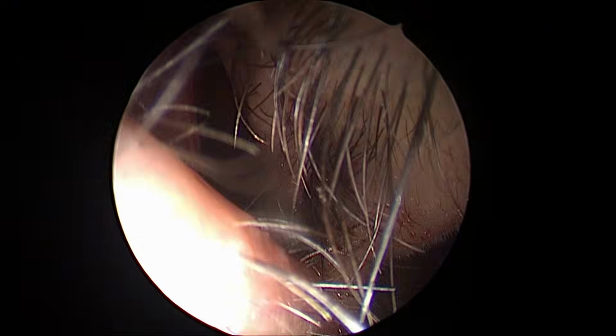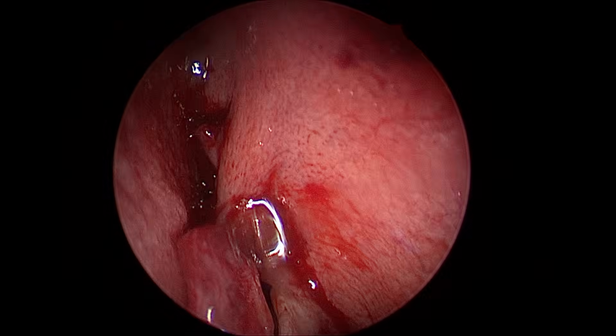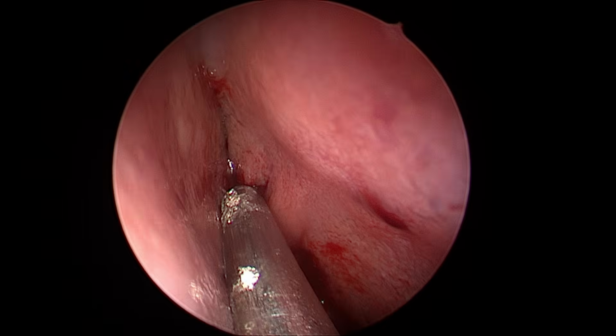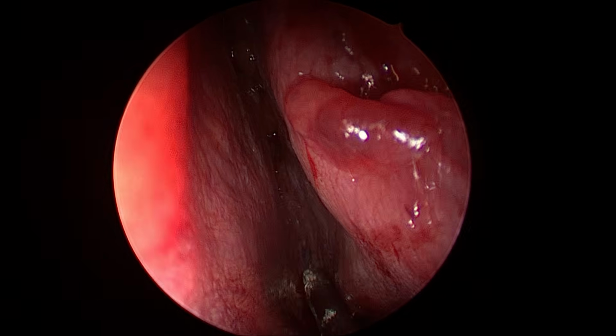Okay, I will show one side so that we can save time for the other case. So now, first of all, look at what the previous surgeon has done. This is the middle turbinate, and there are polyps medial to the middle turbinate. See this? Yes, sir. This is the olfactory region.